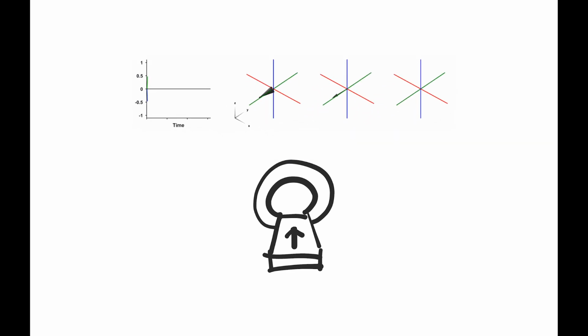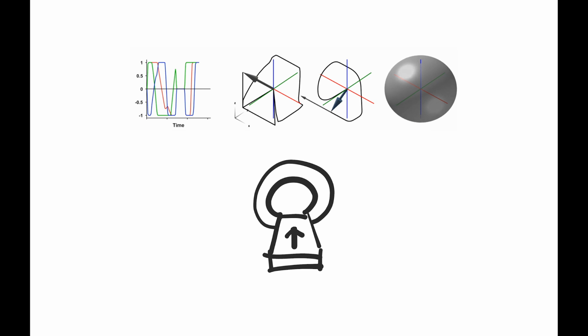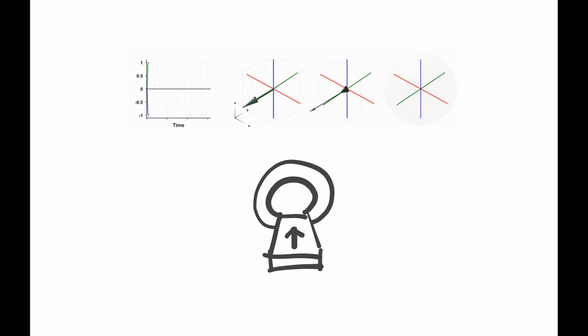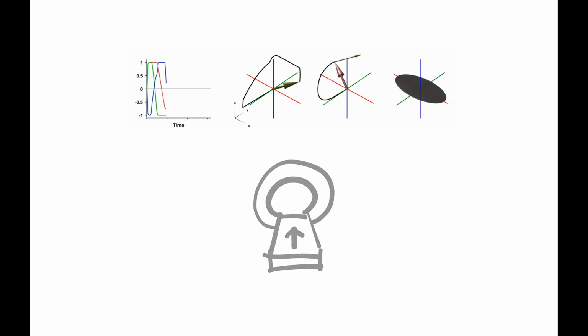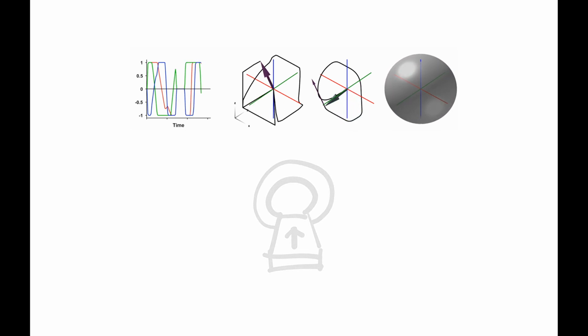We realized that similar information separation could be attained in the clinic by leaving the patient stationary and instead rotating the magnetic field gradients during the diffusion MRI acquisition. Through this novel acquisition technique, also known as multidimensional diffusion MRI, or MDD, we alleviate the lack of specificity of diffusion imaging, circumventing the use of invasive procedures with known side effects.